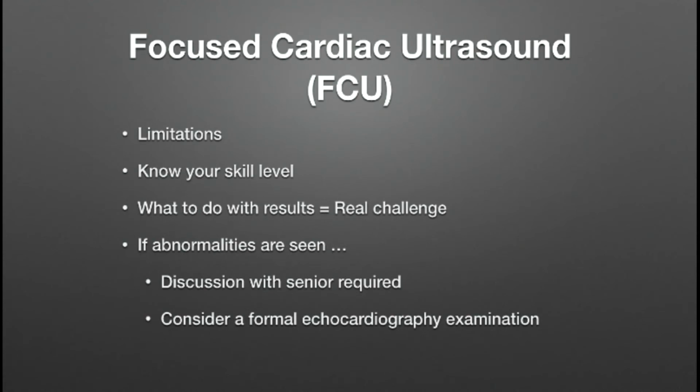I'd also like to say on the flip side that you have to try and make some conclusions, and actually put these into clinical practice. This is a fantastically powerful and useful tool, I believe, as long as you've had sufficient appropriate training. And probably the most difficult thing I find isn't teaching people how to do this imaging, it's what to do when you've got the results.